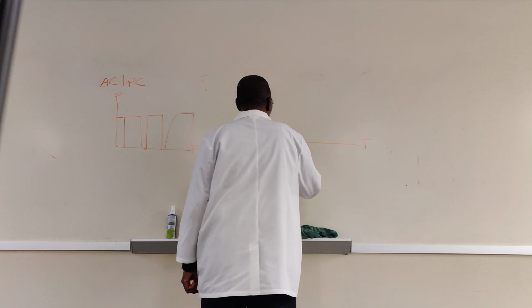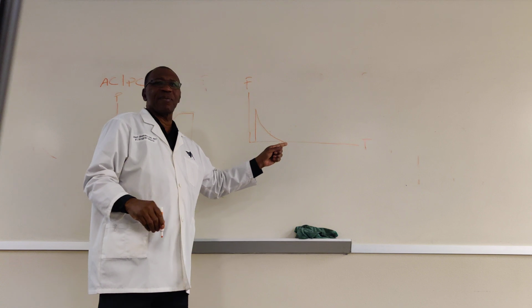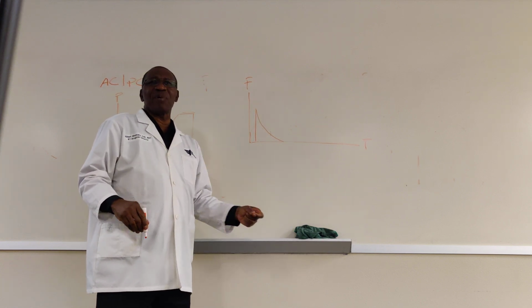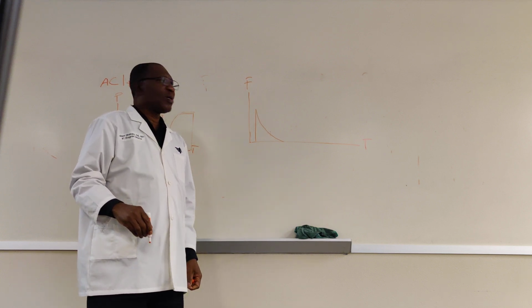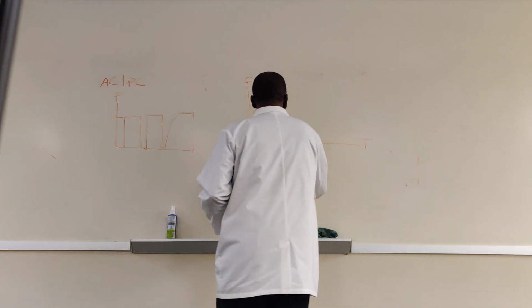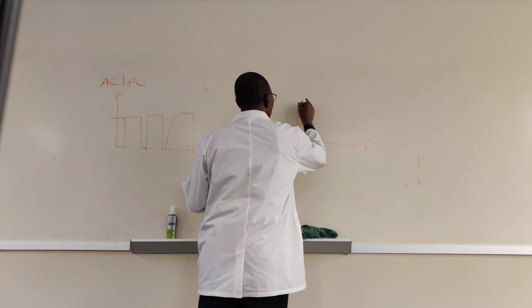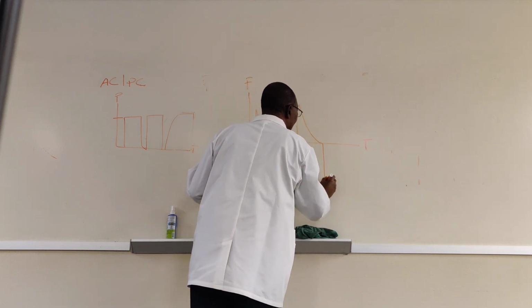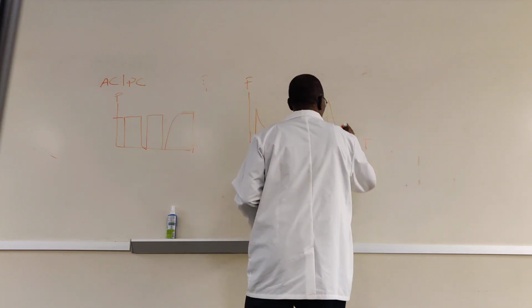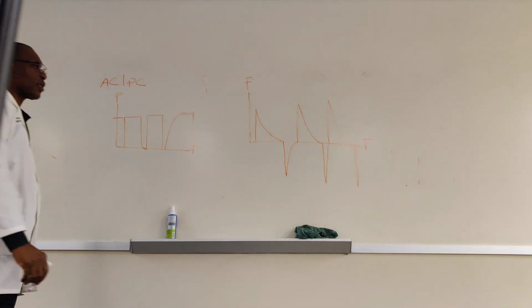and this time now, remember this is not a spontaneous mode, so we're not going to set the expiratory sensitivity. The expiratory sensitivity is only available for you to set on a spontaneous mode. So this is going to come all the way to baseline, like that. Okay? That's the major difference between pressure control and pressure support. So that's what pressure control is going to look like.